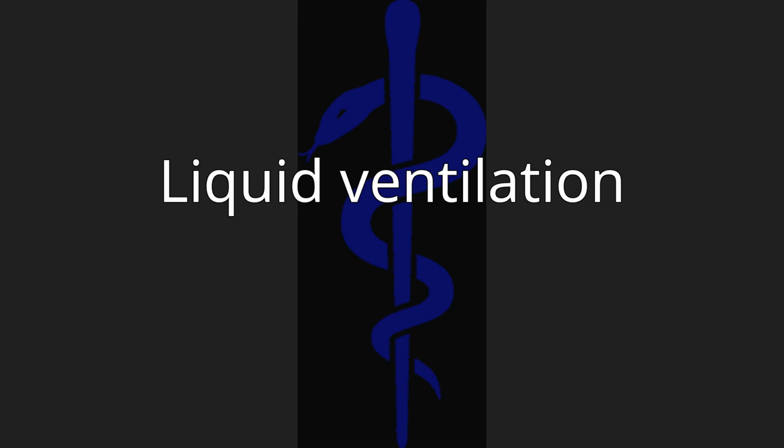Liquid ventilation. Liquid ventilation is a technique of mechanical ventilation in which the lungs are insufflated with an oxygenated perfluorochemical liquid rather than an oxygen-containing gas mixture. The use of perfluorochemicals, rather than nitrogen, as the inert carrier of oxygen and carbon dioxide offers a number of theoretical advantages for the treatment of acute lung injury, including reducing surface tension by maintaining a fluid interface with alveoli, opening of collapsed alveoli by hydraulic pressure with a lower risk of barotrauma, providing a reservoir in which oxygen and carbon dioxide can be exchanged with pulmonary capillary blood, and functioning as a high-efficiency heat exchanger.